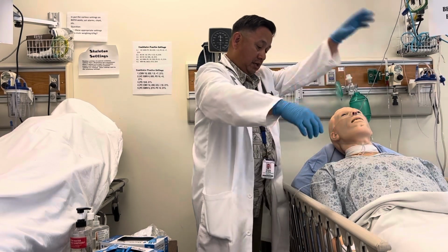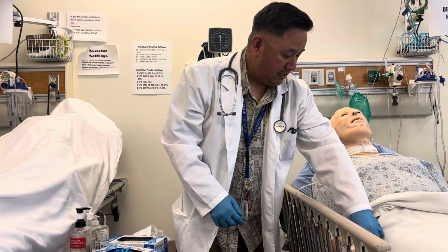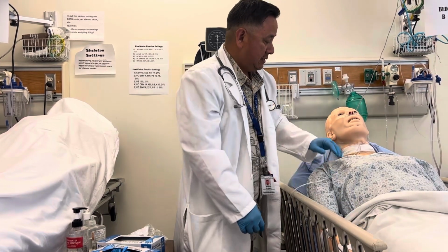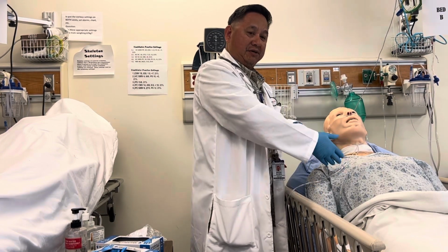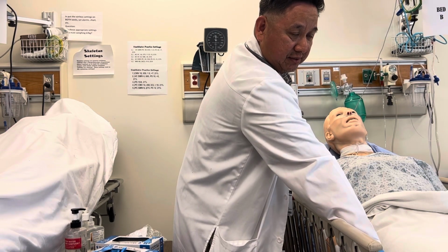Everything looks good. I'm going to go ahead and take another set of vitals from you. Take another pulse for a full minute. Take a respiratory rate for a full minute. I will auscultate anterior, posterior, and take another pulse ox check.